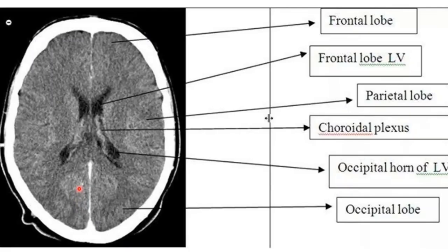On this image, as a revision of anatomy, you can appreciate the frontal lobe, and going down, the frontal horn of the lateral ventricle, the temporal horn of the lateral ventricle, and the occipital horn of the lateral ventricle. Between the lateral ventricles you can also appreciate the choroid plexus. The fibrous dural septum called the falx cerebri is also appreciable on this image.